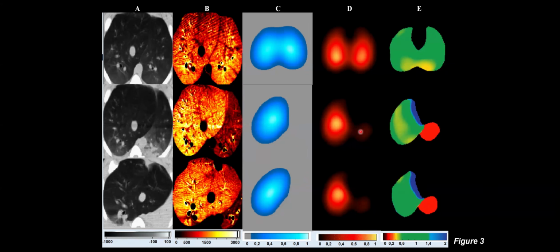Despite this very low perfusion, EIT was not indicating any suspicion of pulmonary emboli, but indeed of pulmonary shunt. So it was a problem of ventilation, not of perfusion. And then we used 100% FiO2. There was some shrinkage of the lung, but still we didn't see any suspicion of pulmonary emboli.